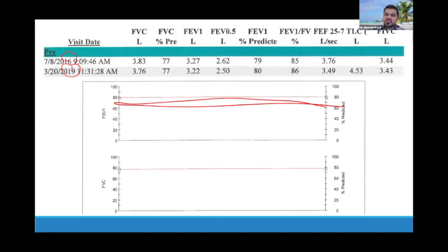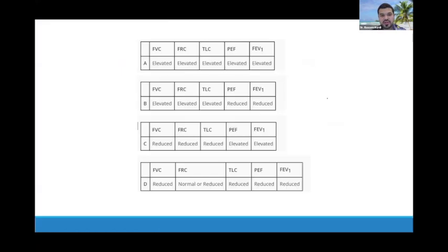And that's the most important thing clinically, not just how the absolute value is, or whether it was below the lower limit of normal, or the percentage is so-and-so. So you have to look into the whole picture in addition to the clinical symptoms, like we said. That's all I have. And I think Dr. Noor has a number of interesting cases for you. Thank you for being with me.